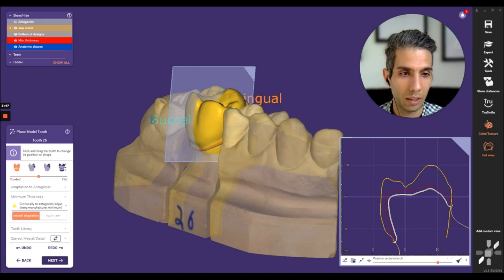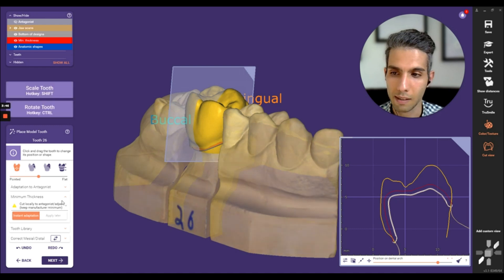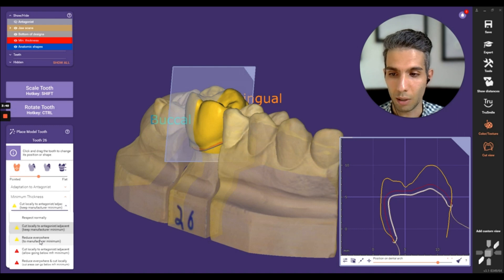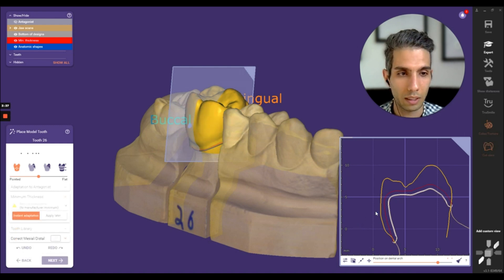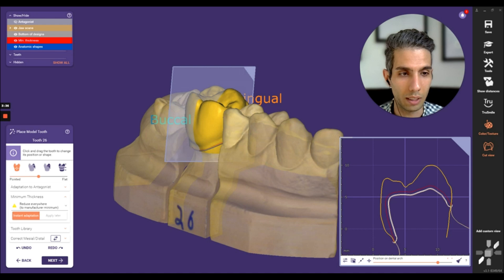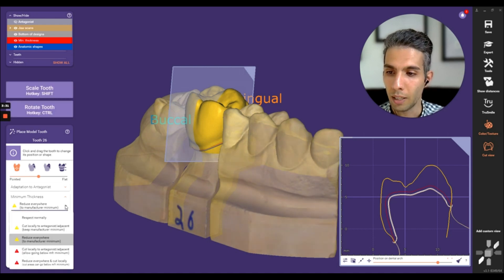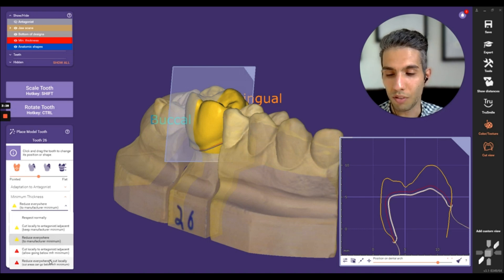The second option, 'Cut Locally to Antagonist or Adjacent,' reduces the minimum thickness as you can see. The second one, 'Reduce Everywhere,' is not just antagonist/adjacent but the whole crown — clicking it, you see how the minimum thickness is affected and adjusted.